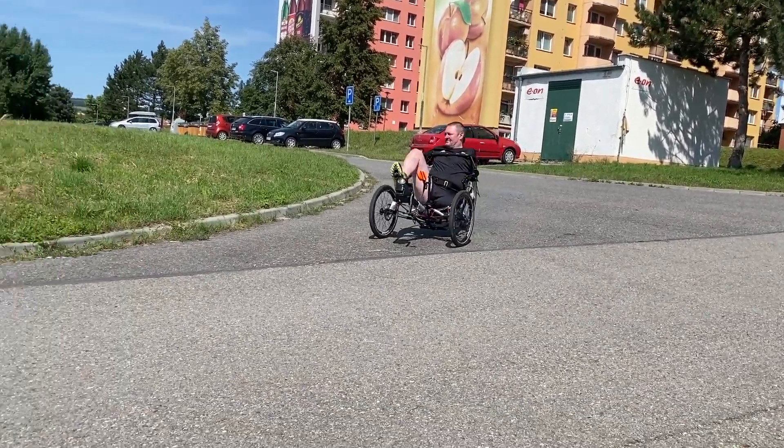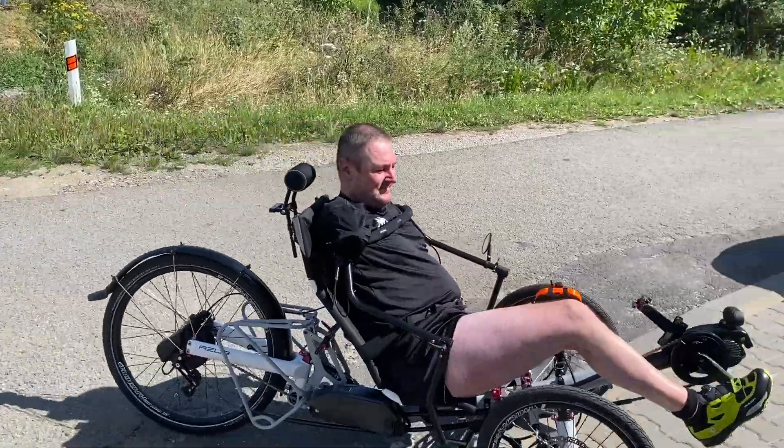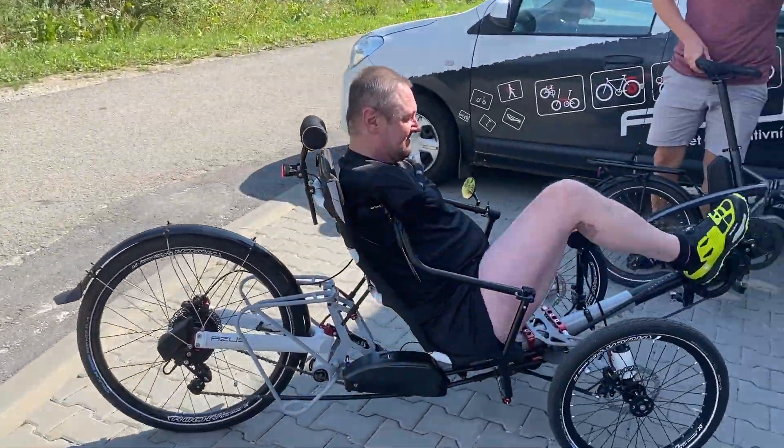Mr. Hoss only needs assistance getting on and off the trike and starting the motor, but he manages the ride as such.